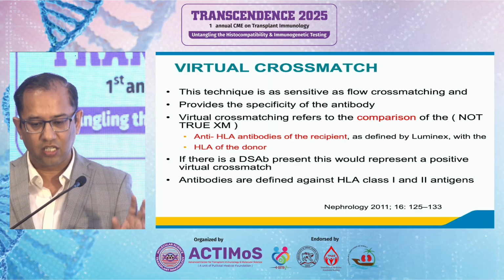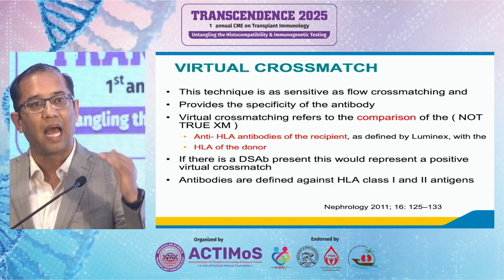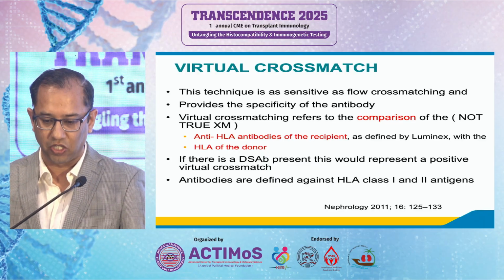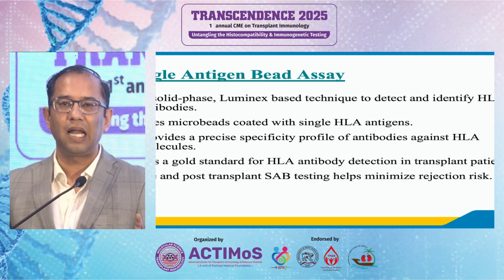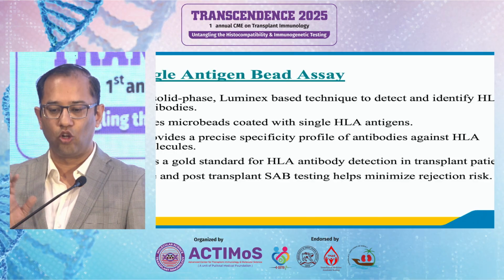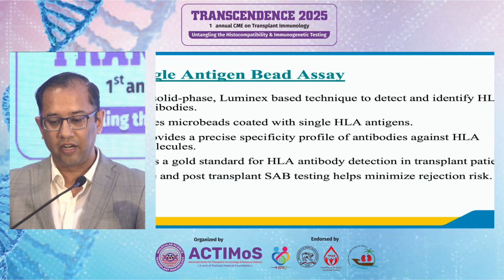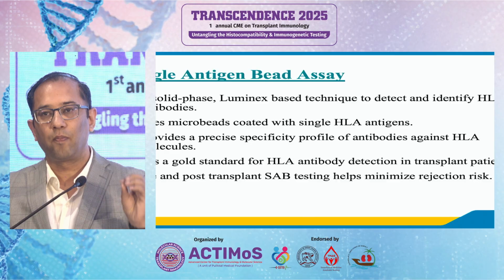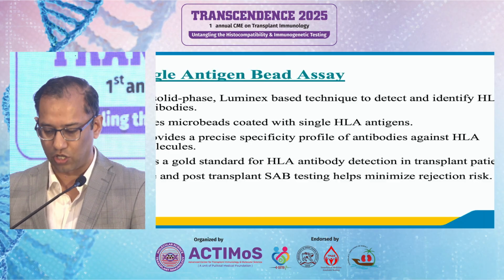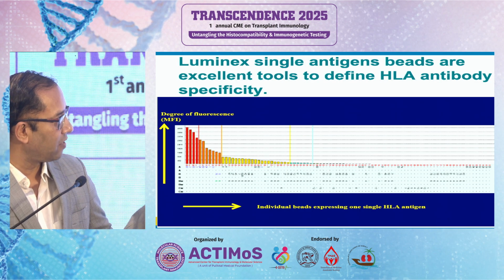So if there is a donor specific antibody, you know the specificity of that antibody, and you can actually monitor that antibody, go for desensitization, and then transplant the patient. So yes, single antigen bead assay is very sensitive and very specific. It is a solid phase Luminex based technique. It will give you the specificity of the antibody, and it will provide a precise profile, and that can be monitored both pre-transplant and post-transplant.